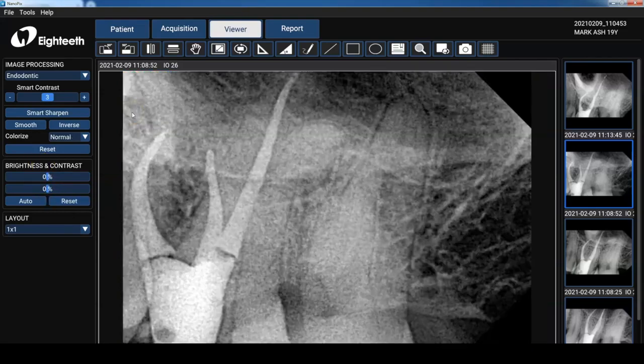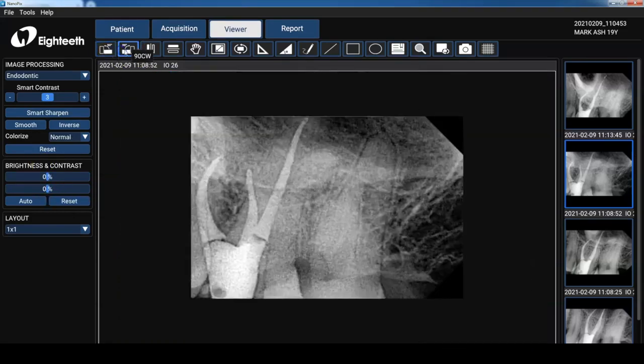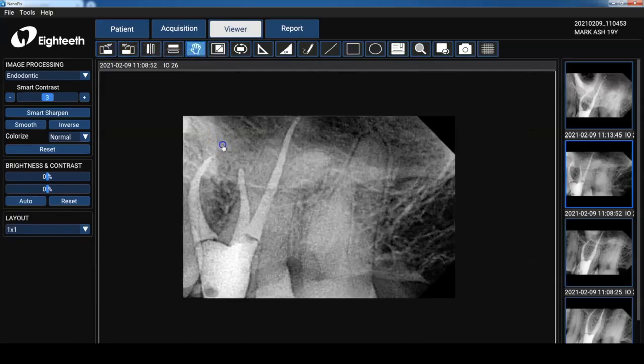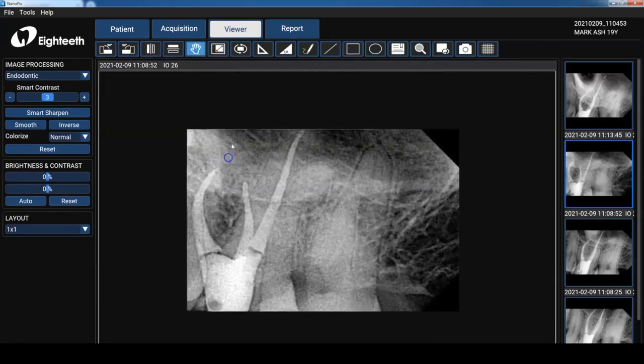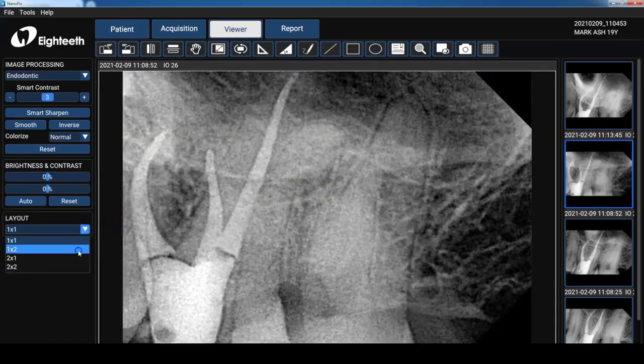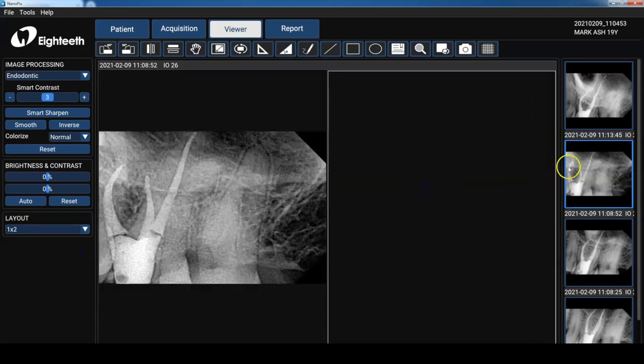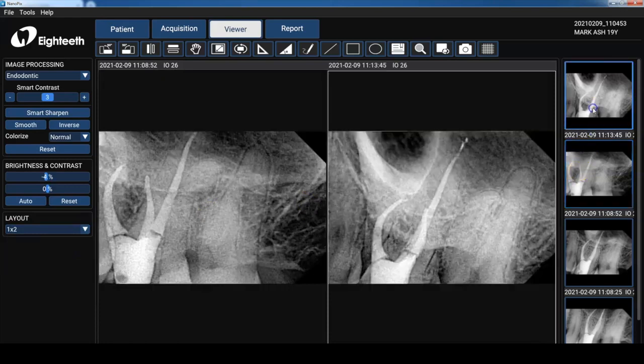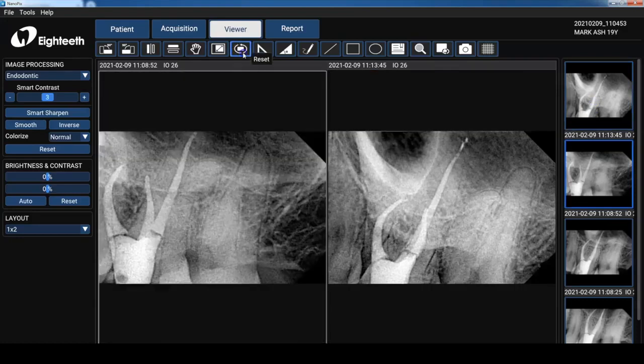So let's take a look above the image at some of the tools that are available. So we can rotate the image, we can flip it vertically and horizontally, we can pan the image around and I'm going to use another image just to compare. So I double click on the window on the right and then I double click on one of the thumbnails and boom up comes the image. So there's a zoom button but honestly I just use a two-finger zoom on my trackpad. I'm going to reset that with a little reset button.